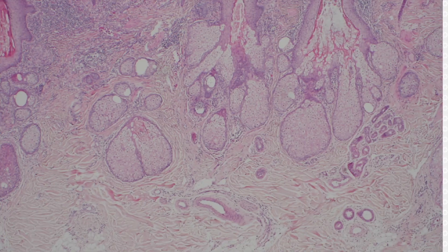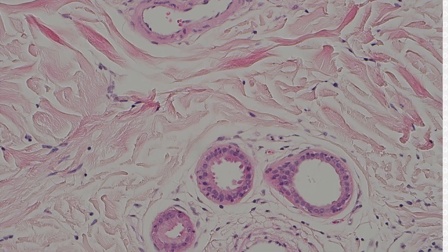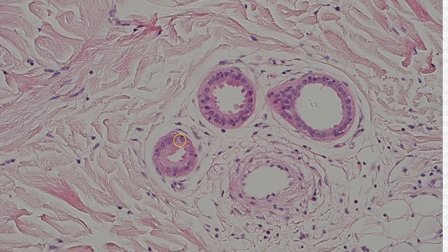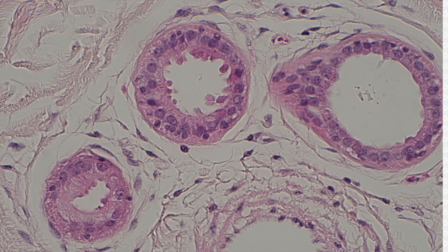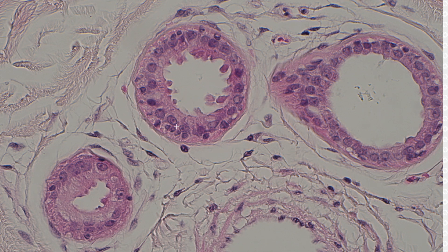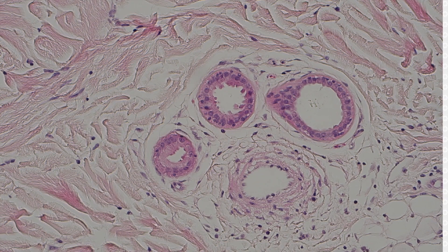The other thing that you'll have in some cases, not always, is the presence of either apocrine glands — like right here, look at those beautiful apocrine snouts. Apocrine glands have these very nice round nuclei with prominent nucleoli. So that's one way, if you can't see good snouts and you're wondering if those are really apocrine, go look — they look like little eyeballs, like little minions. Someone on Instagram told me that once and I thought that's really fun.